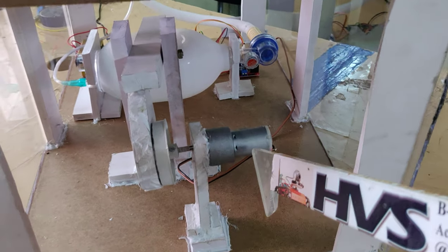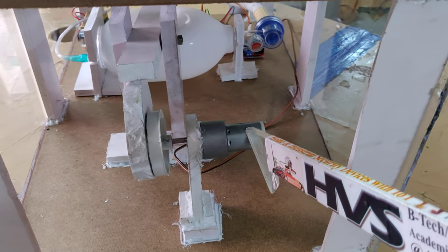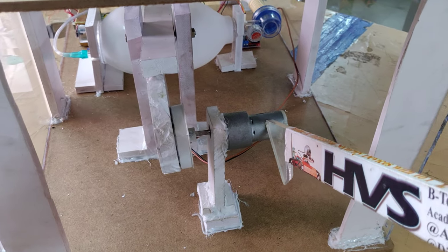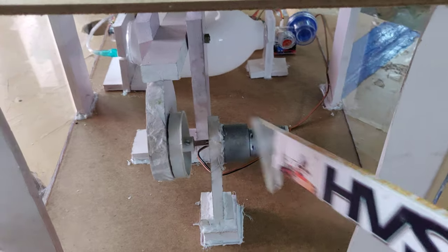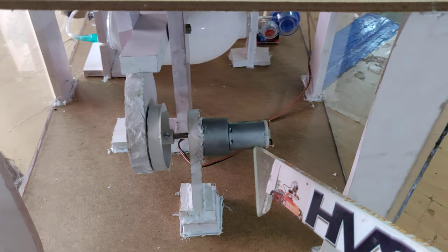attached to the base DC motor. The base DC motor RPM is 18,000 RPM, and that is stepped down to the 10 RPM DC motor. The gear reduction is from 18,000 to 10 RPM, so that we can get around 25 kg of torque after this gearbox gear reduction, and it is operated on a 12 volt input.